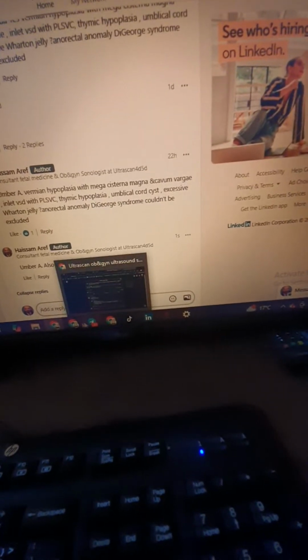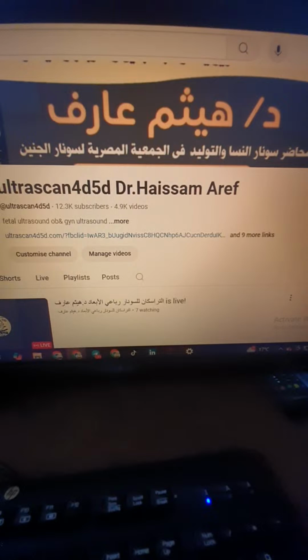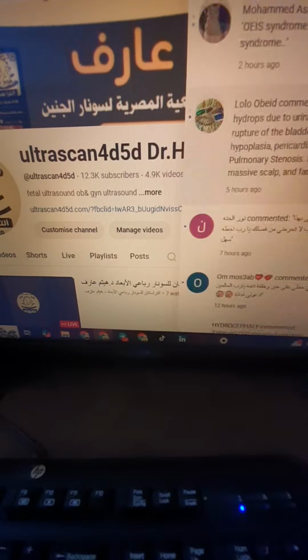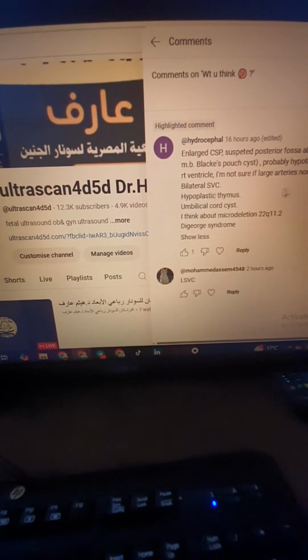And I need to see here the answer from my friend from Ukraine. Let's go see an answer from my friend from Ukraine. Enlarged CSP, suspected posterior fossa.